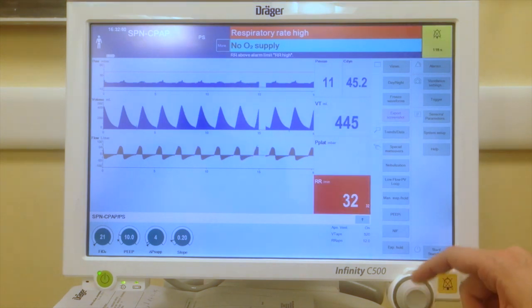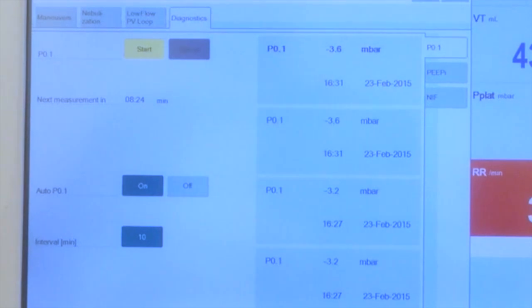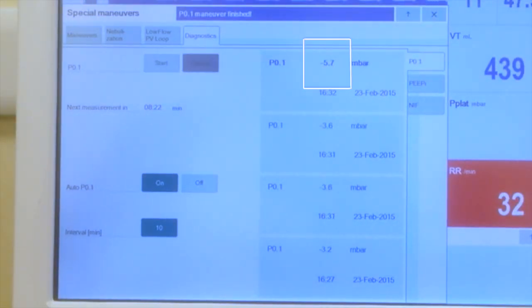Let's see what happened to P0.1. We go again on Special Maneuver, then press Start, and confirm that the patient's effort has increased significantly.